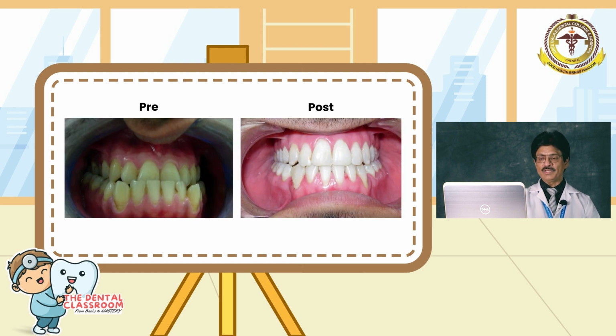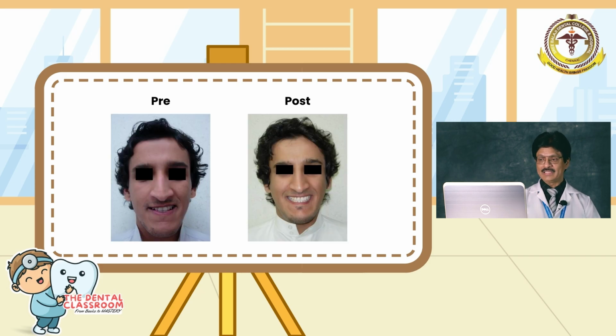And this is how the patient was at the end of the active orthodontic treatment with microimplants. On the left side you see the pre, and on the right side you see the post, and you can see the patient has a beautiful consonant smile arc. So all these borderline cases where the need to go for orthognathic surgery arises can be successfully treated with the use of microimplants. This is just to show an example of what microimplants can do.